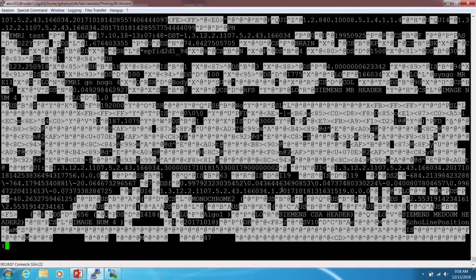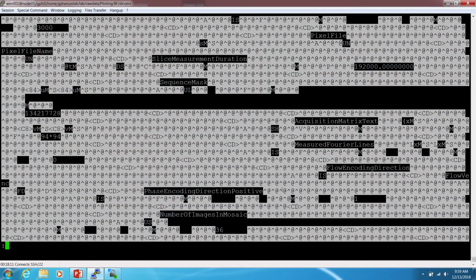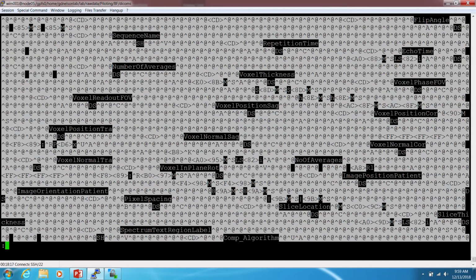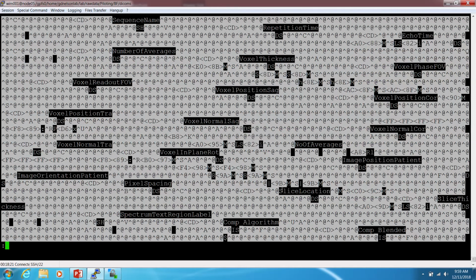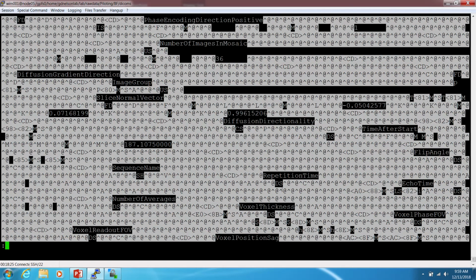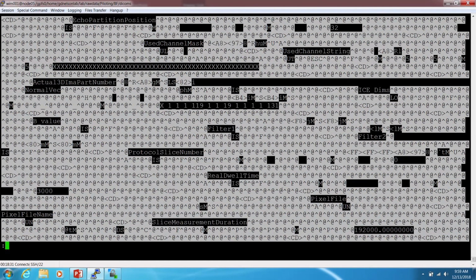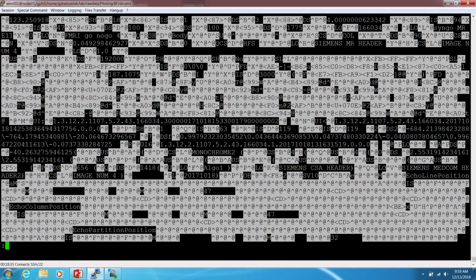If I go a really long way, you end up with a lot of information that's kind of gibberish, and eventually you get into straight binary, which is the raw data coming out of the scanner. But there's also a lot of tags here that give you information about, you know, what the protocol and slice number was. So some of it's plain text and some of it isn't.